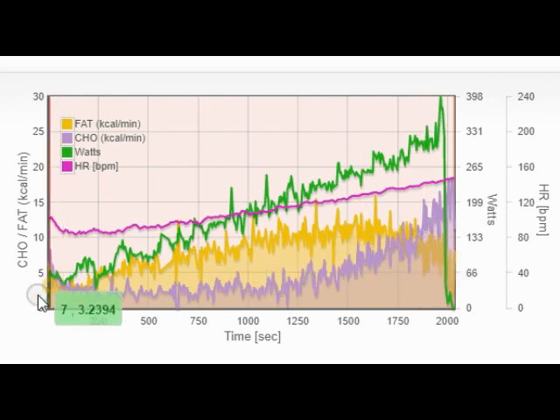So we're going to find out where you sit. How do you test? Induce a stress, see how your heart responds to that stress, and see how your energy metabolism responds and covers the cost of this activity. I'm going to go through and show the less than optimal outcome next, and if we find that's you, we're going to change that. There are things we could do. We are not helpless. But the first step, my friends, is to identify where you're at.